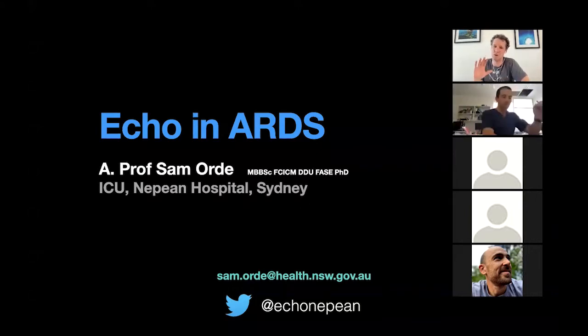I'm going to split this session into two parts. One is this echo and ARDS talk that I've been preparing, which I think might be good for the exam to talk about a systematic approach to vivas. And I'll fire off just a few questions with every echo image I bring up.